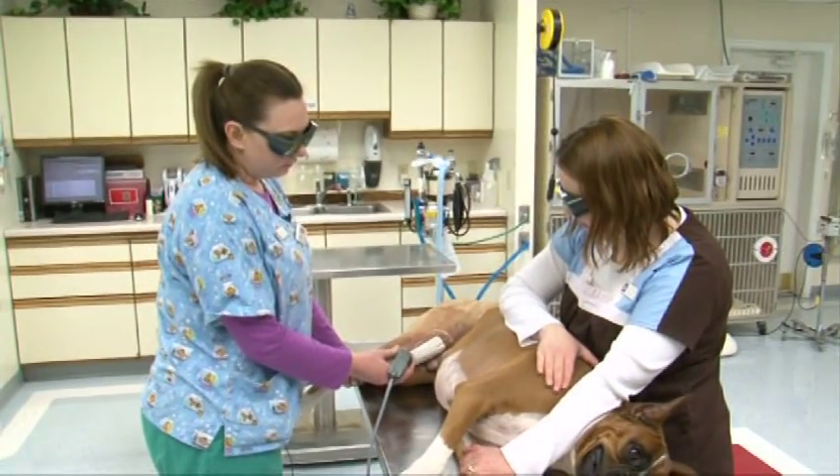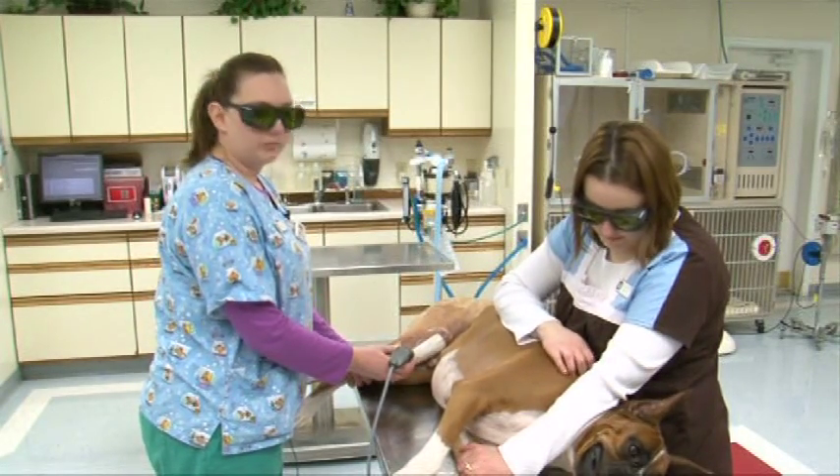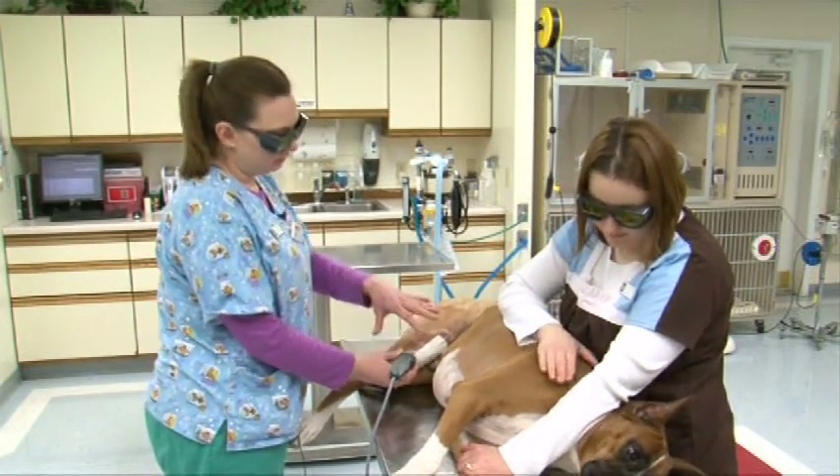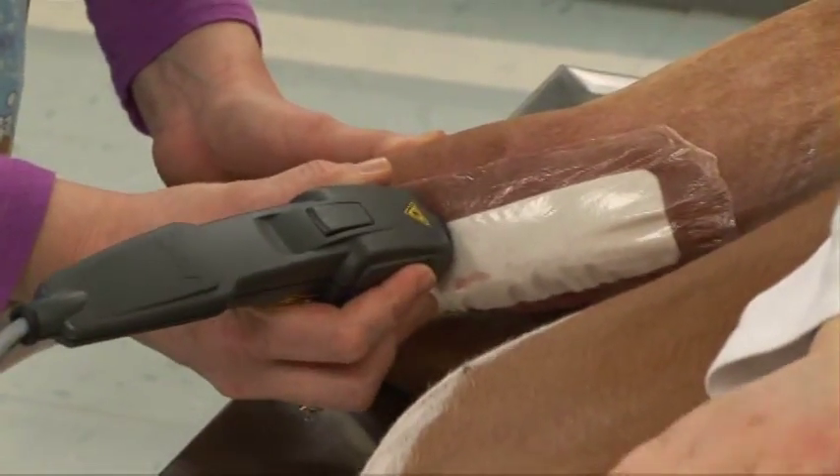Right now I'm just going over the six different points. What it's trying to do is open up the blood flow through to the actual site that we are treating, and it will give more mobility and less pain.